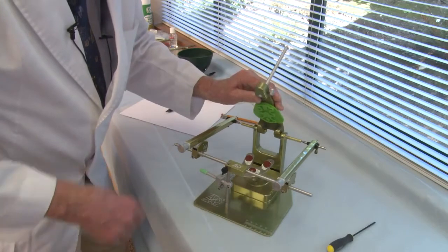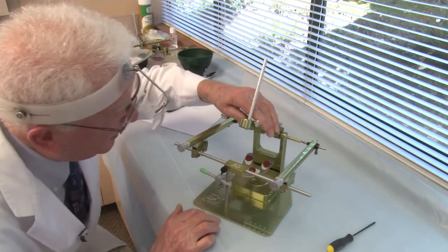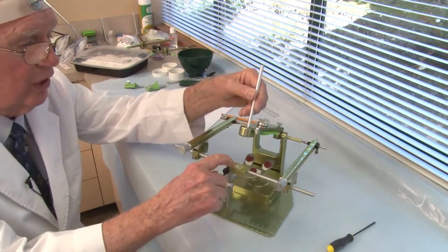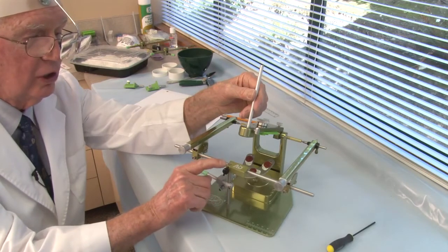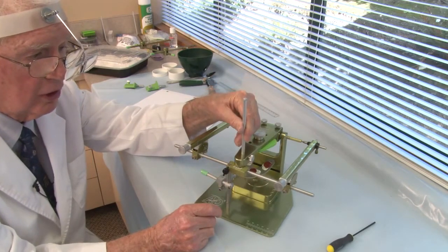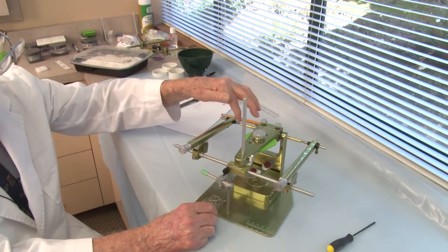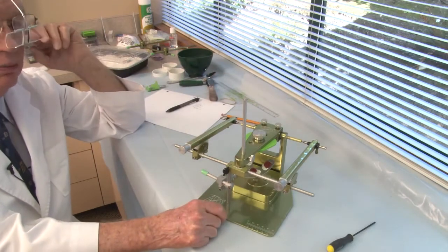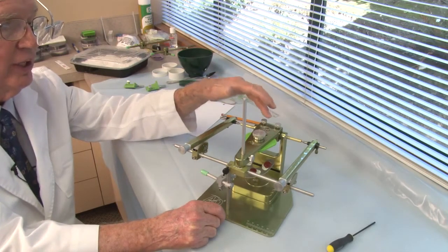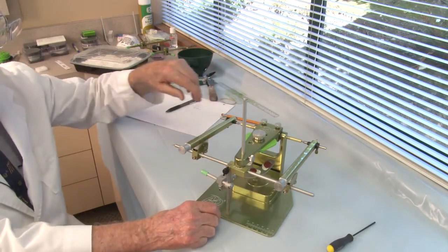Now then, I turn this over. This pin has to be completely out of the way and touches here. That's the third. Remember, this is the third reference point right here. Remember when we did that on the patient and the bite fork assembly? That established his third reference point, orbitally. We got a hinge point, so we've got 3 points. 1, 2, 3. 3 points make a plane. So we are mounting these models, this upper model, on the axis orbital plane. And that's the way it's all established.